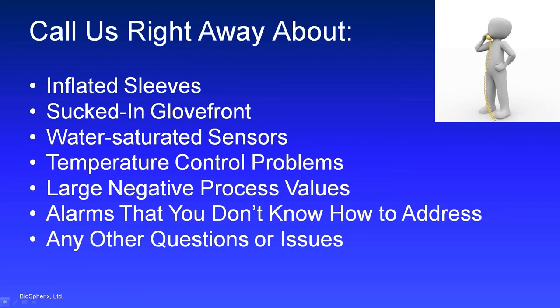If you accidentally water saturate a sensor and you don't know how to dry out the sensors, give us a shout. We're happy to walk you through that. If there are any temperature control problems, it seems like the chamber floor is having trouble keeping the temperature up to 37, please give us a call.